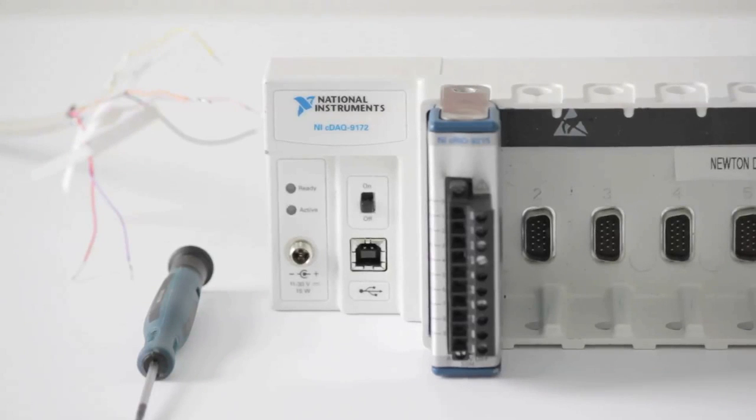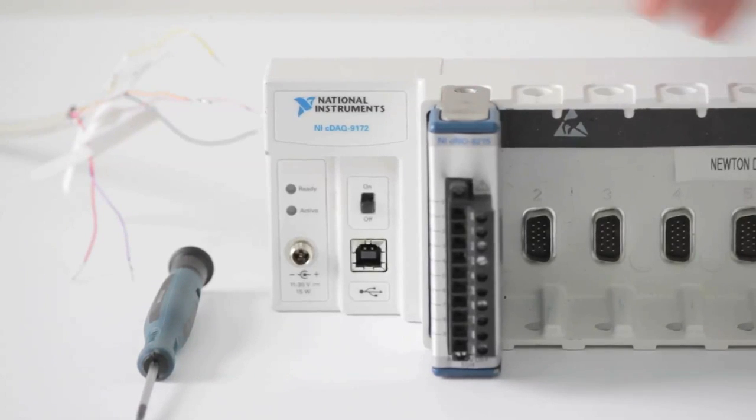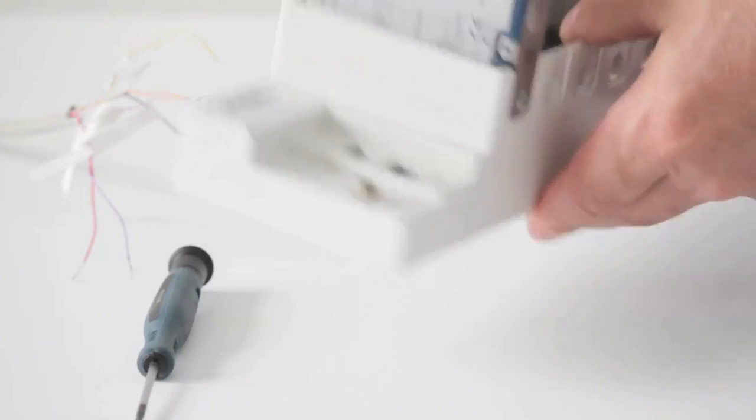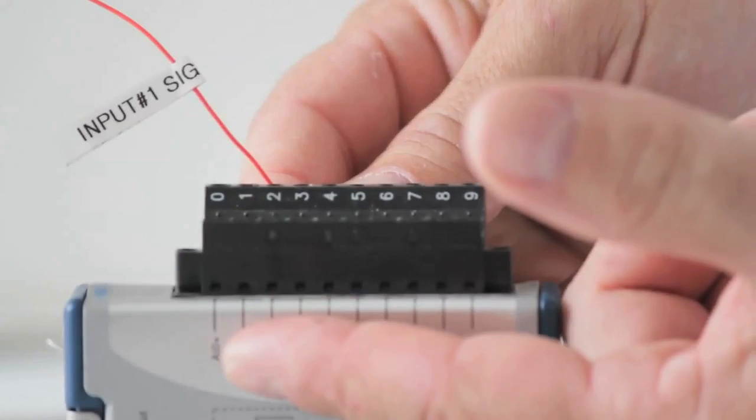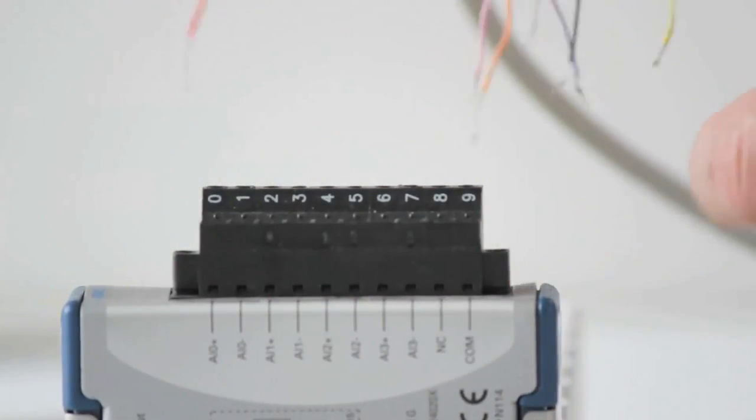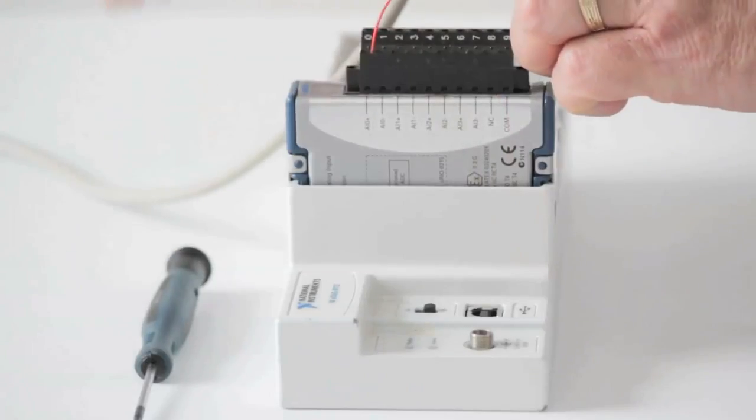The next step is to make the wired connections from the sensor isolator to the DAC using a DB15 breakout cable. Keep in mind, channels 1-4 should be connected in a logical sequence to the analog inputs of the DAC.